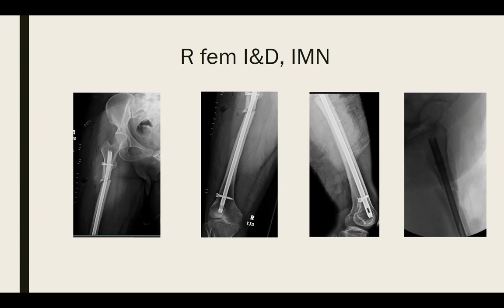During the case, we placed this nail, then replaced it with a longer one, but with the longer one there was prominence and the patient was small, so we couldn't accept that. So we made the decision to put in the shortest nail a little bit deeper, and we fixed this with a little valgus.